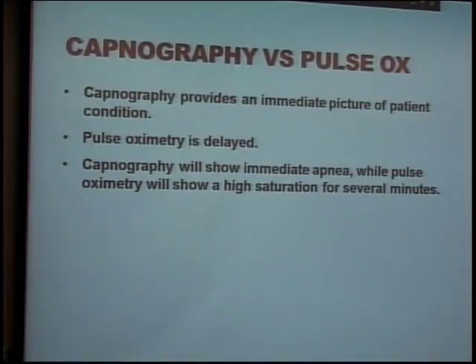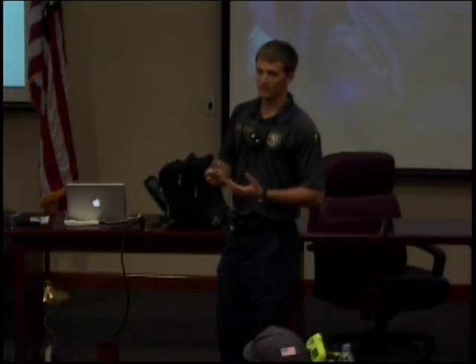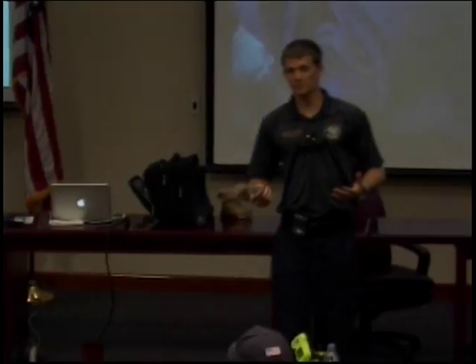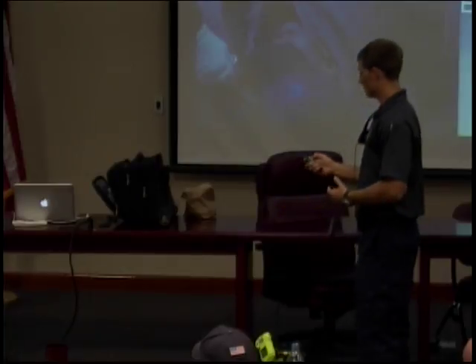Your capnography versus your pulse ox. Capnography provides an immediate picture of the patient condition. Pulse ox is delayed. Capnography will show immediate apnea, while pulse ox will show a high saturation for several minutes. A good way to test this: if you have the probe on your finger, you're reading whatever your number's at, you hold your breath, chances are you'll have to breathe again before you even see your numbers drop. So it's not immediate, whereas if you have the capnography on, it'll show when the patient stops breathing. It's more immediate.